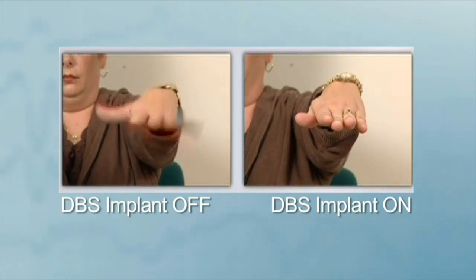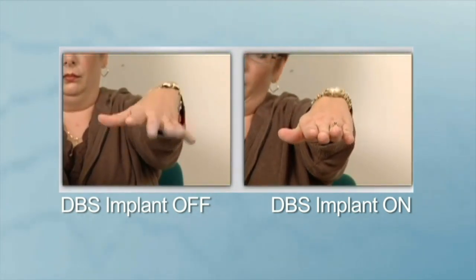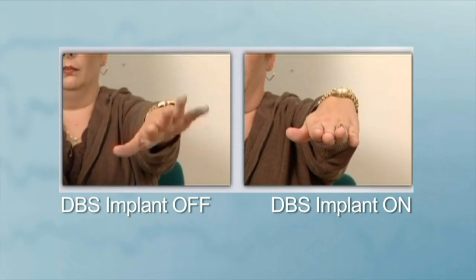Deep brain stimulation for dystonia is somewhat different to deep brain stimulation for other conditions such as tremor. With deep brain stimulation for tremor, the tremor usually stops fairly instantly. Dystonia responds differently for reasons that we don't understand. Generally speaking, the benefit that a patient obtains from dystonia comes on fairly slowly and builds up over a number of weeks or months. Patients with dystonia shouldn't expect an instant benefit. The benefit that they get will usually come on slowly, and it'll usually build up in a gradual fashion over 6 or 9 months. So they do need to be patient.